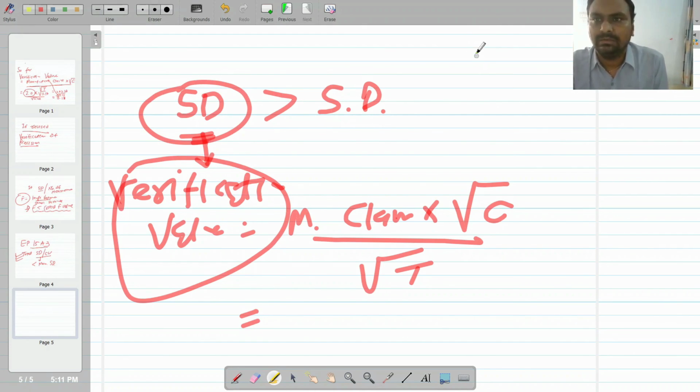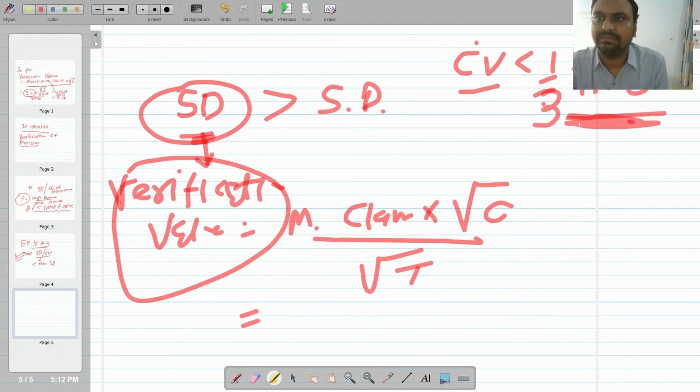Alternatively, you can run the control at both levels, and if the CV is less than 1/3 of the CLIA total allowable error, then our precision is also valid. This is all about today's video regarding the verification of precision.